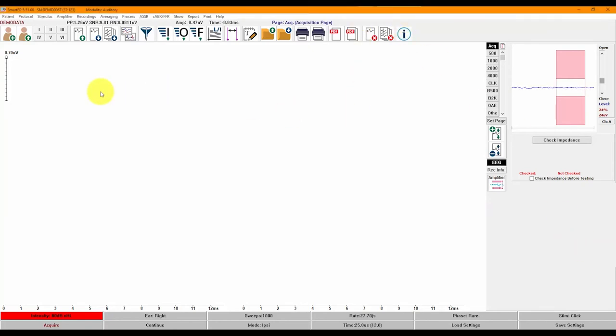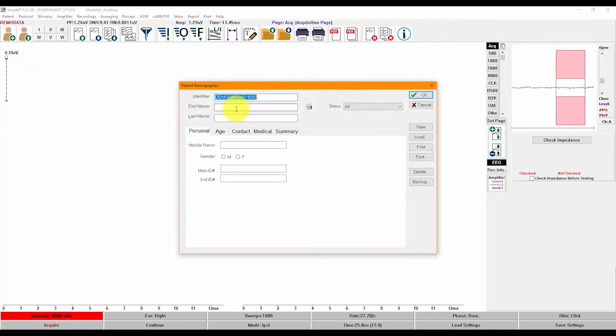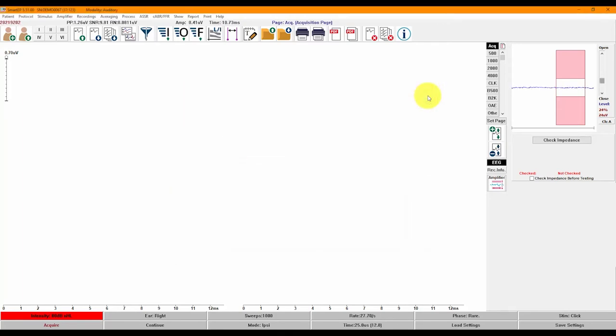Let's begin recording. First, I will create a new patient file by clicking on the new patient icon on the top left and entering the patient's information. You can enter as much or as little information as you want beyond the required first and last name fields. If you wish to enter a medical record number, please enter it in the main ID field. The EEG button on the right side of the screen opens a viewing panel for the incoming EEG, which can be displayed or hidden at any time. Before beginning acquisition, the impedance can be checked on the screen, with the value for each electrode displayed. The blue line represents the incoming EEG, and the red shaded area is the artifact rejection region.